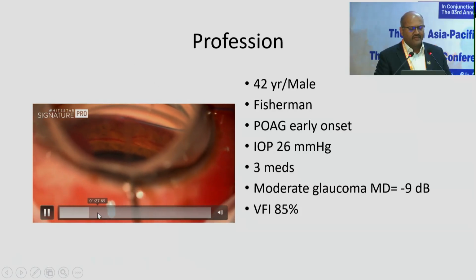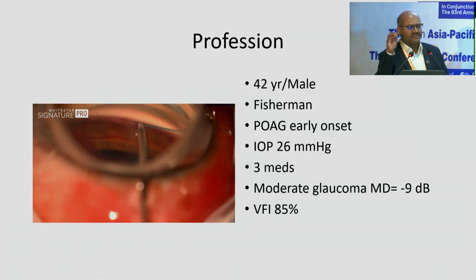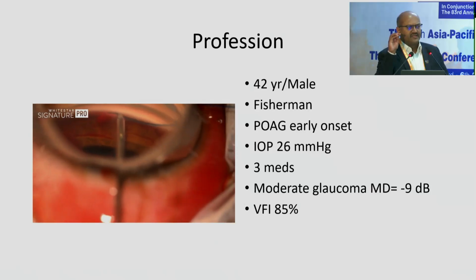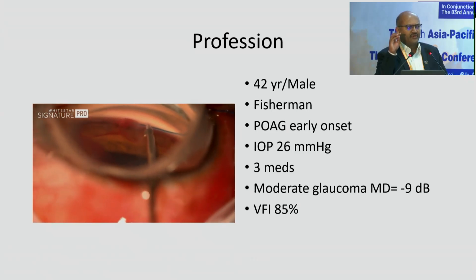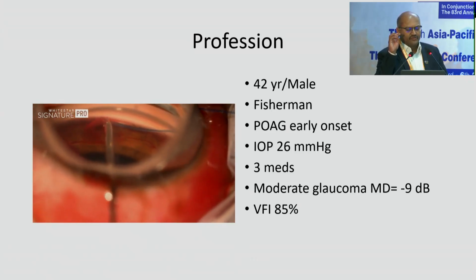on the opposite side. As you would notice, the suture, as it is coming out, will push a blob of blood from the opposite side. So you keep looking at the opposite side of the entry. You can see that the Schlemm's canal gets filled with blood, and the suture, which is blunt tipped, which is umbrella, will keep pushing the blood forward, because immediately after you induce hypotony, the Schlemm's canal is filled with blood. So you look at the opposite side.